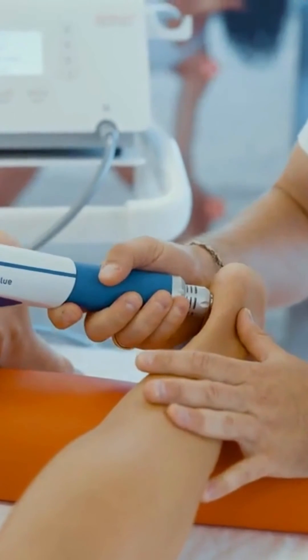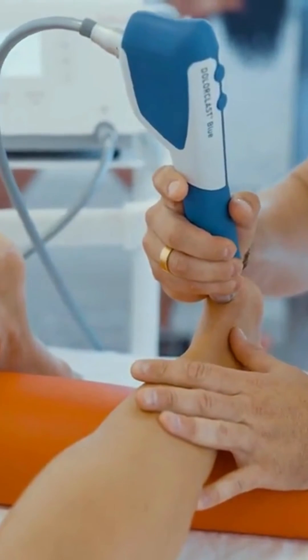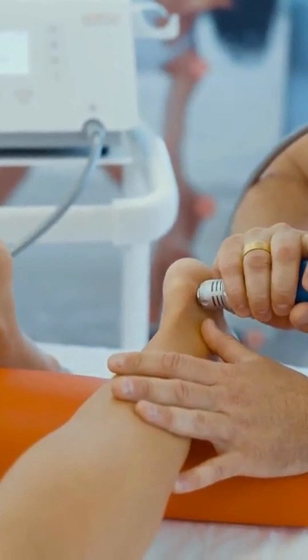Application on spheric body parts like the heel can be provided using circumduction around the painful point. The handpiece should remain perpendicular to the tissue at all times.